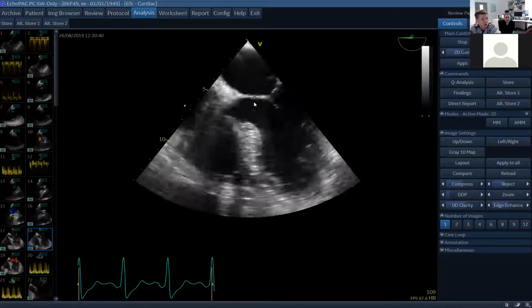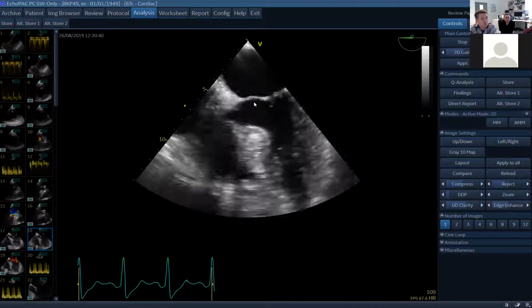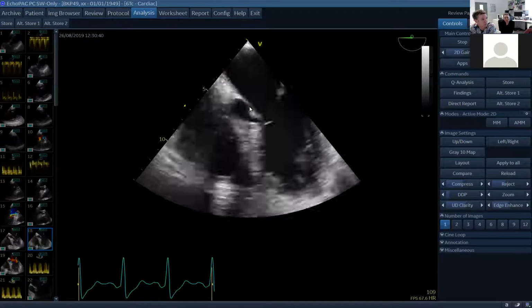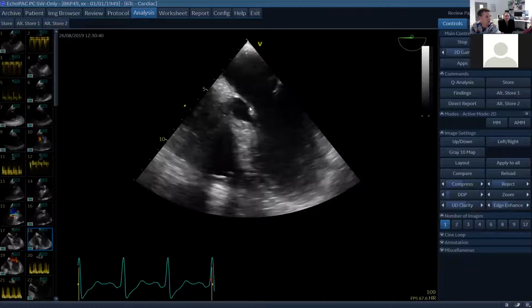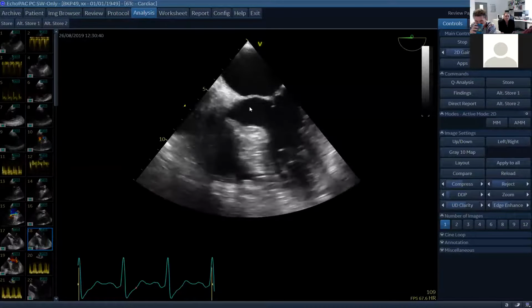So if you ever get stuck, where's the aortic valve? Where the cursor is, the aortic valve is up under here. And what's always next door to the aortic valve is the anterior mitral. No, that's the leaflet, the mitral. Nice. I was thinking you were asking for A1. Oh no, just tell me if it's anterior or posterior. Anterior on the left and posterior on the right.